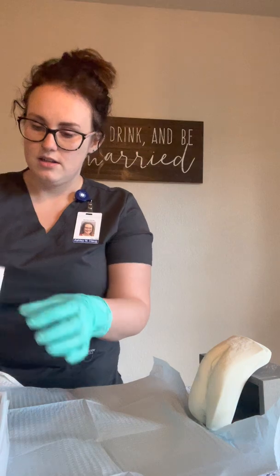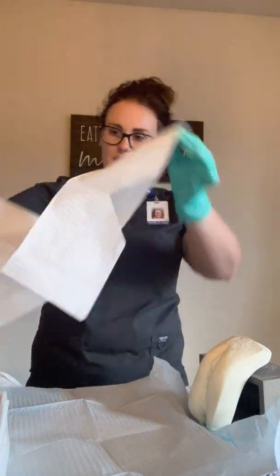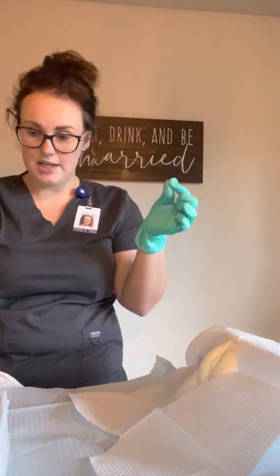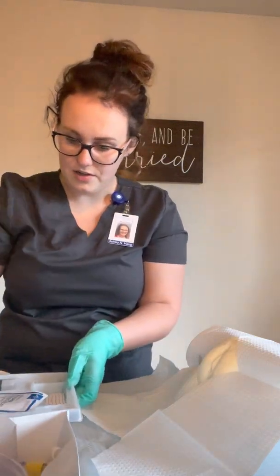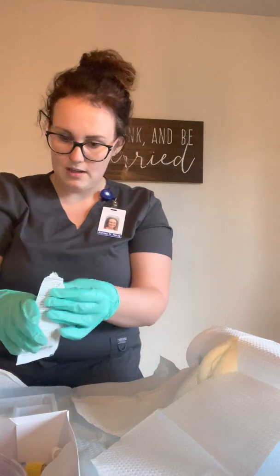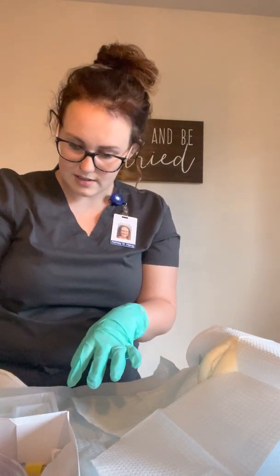Next, I'm going to touch just the outer corners of my fenestrated drape and place this right over the perineal area where I will be working. And then I'm going to organize the items in my sterile field. So I'm going to open up my alcohol swabs, which would really be iodine. I'm going to get those ready and accessible.